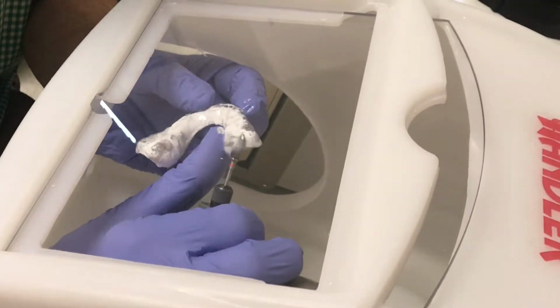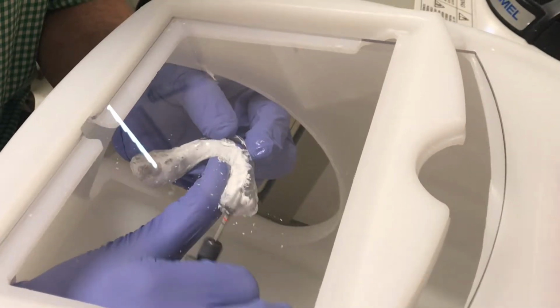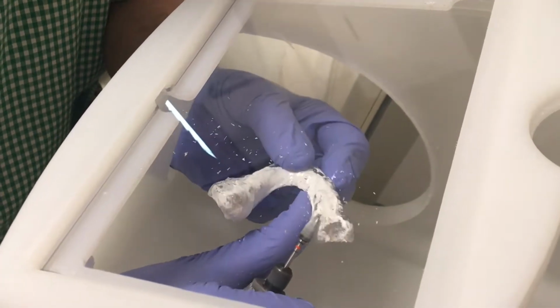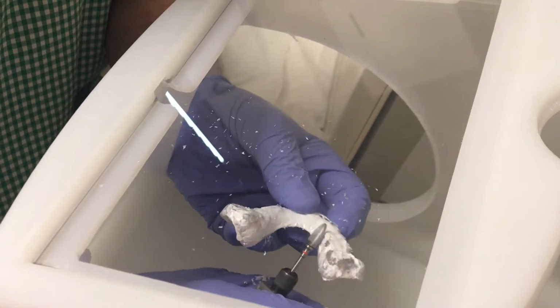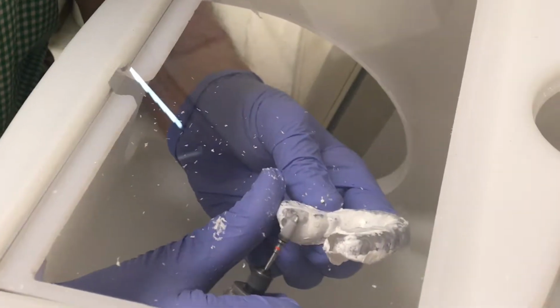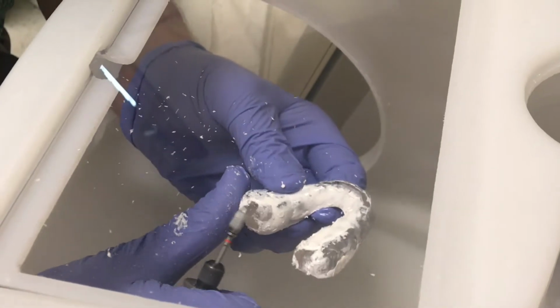So I'm adjusting this so he has a little groove back here. And I'm taking a little off of the right side so he can come farther forward. And maybe even reducing a little bit back here, letting him come up into the central groove.